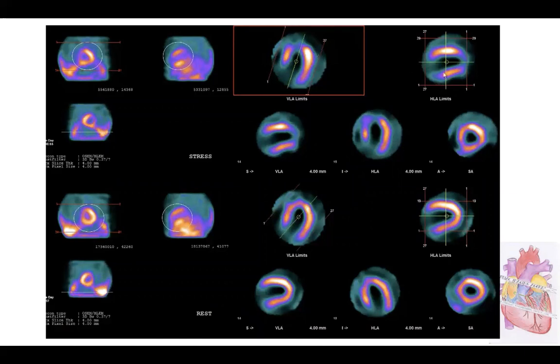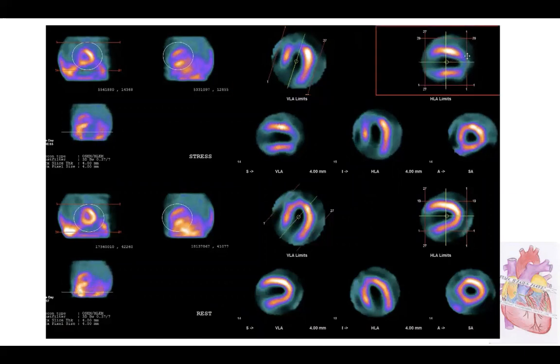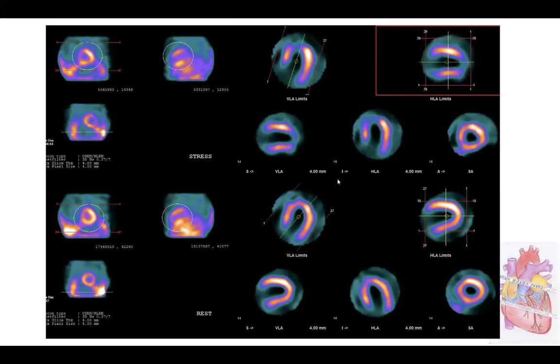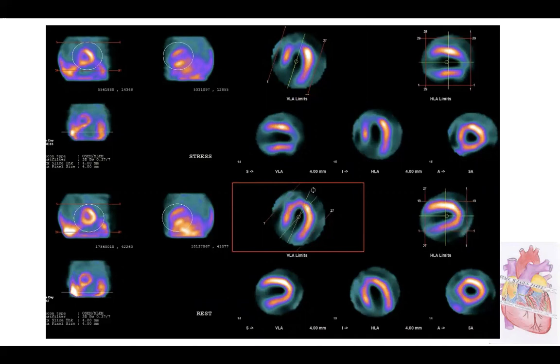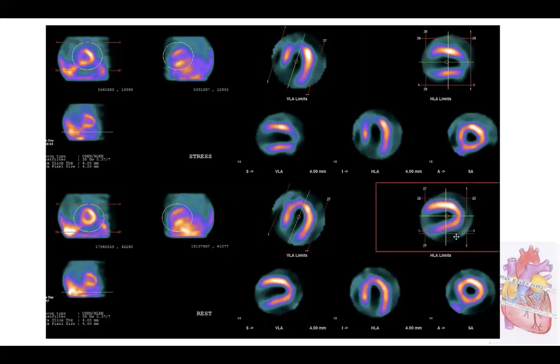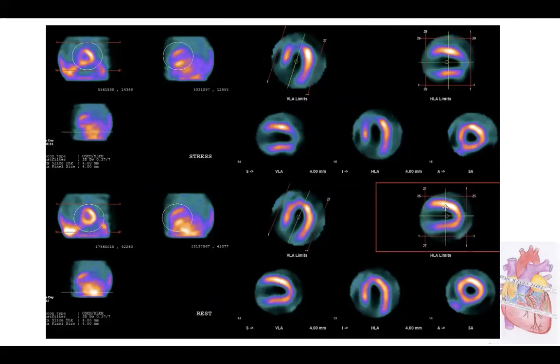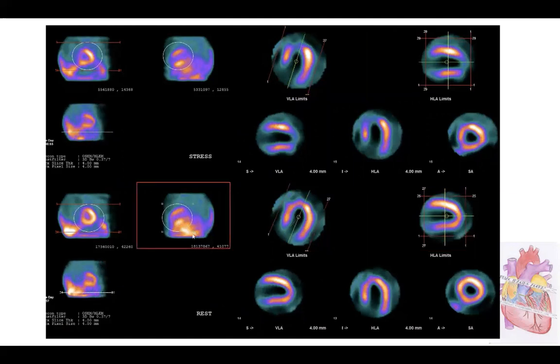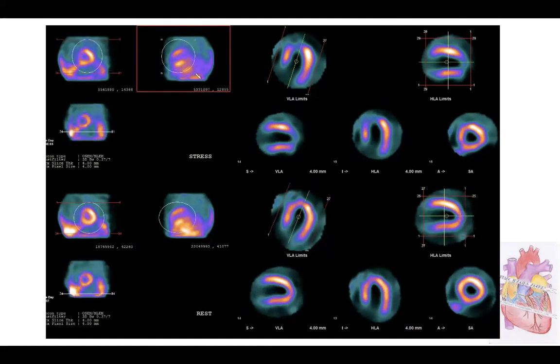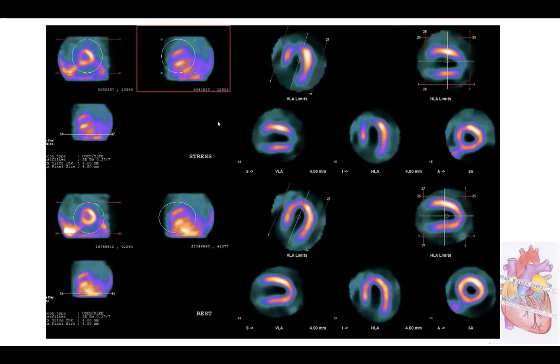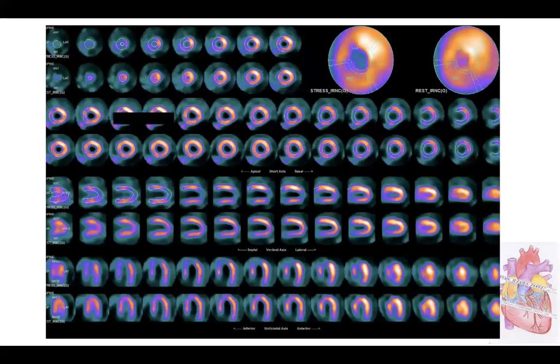We acquired stress first and then rest. It is very important to obtain the best realignment and we need to be sure that the alignment of the stress and rest tomographic data are completely the same, in order to obtain at the end very good quality images for visual and quantitative evaluation. It is really very important to ensure the heart is centered in the picture.